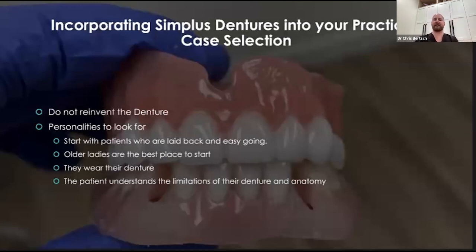The biggest thing, I should put this in bold, the biggest thing I've learned with dentures is don't reinvent the denture. When I first started and I was doing that traditional workflow, I was starting with the alginate, the PVS, and I would try to get the patient in the perfect CR and get all the phonetics and everything different. And in the end, you're giving them a brand new denture, but we all are creatures of habit. What I've learned is that people don't want a brand new denture. They want their old denture with new teeth or with a reline. They want as seamless a transition as possible, so that when you put the new denture in, it feels like the old denture, but better.